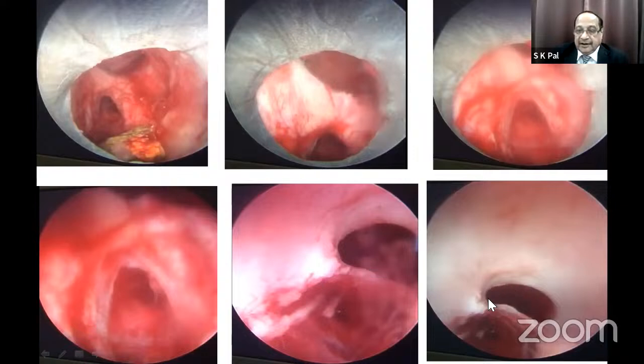And this was a direct entry into the segmental vein, which is just outside, below the infundibulum, the area which I showed in the previous slide. I could go inside this with the 12 French nephroscope. I visited up to the inferior vena cava and came back. So all this is possible.